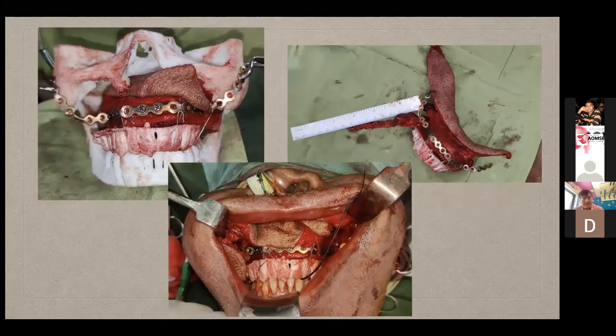And we did that. So for the first patient, we just arbitrarily developed a preoperative record of the maxilla, fixed it to the mandible, and the fibula was then fixed onto the arbitrary record which we then made. Once that was done, the fibula was put on the mandible and IMF was placed, and we then adapted it.